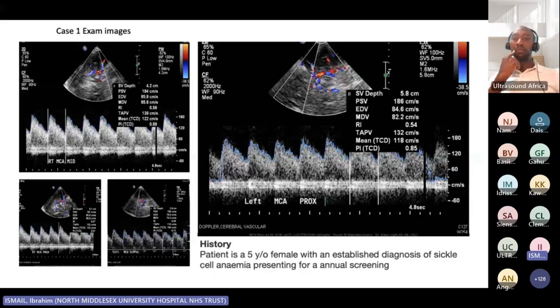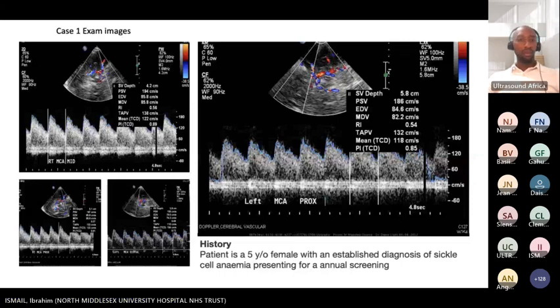If it was more of a peak systolic velocity, then you can look at it here and understand that the peak systolic velocity is above 180, as you can see here. But you can't distinguish what the time average velocity is. So it's something I would always allow the correct settings and the correct parameters on the ultrasound machine to establish. Thank you.